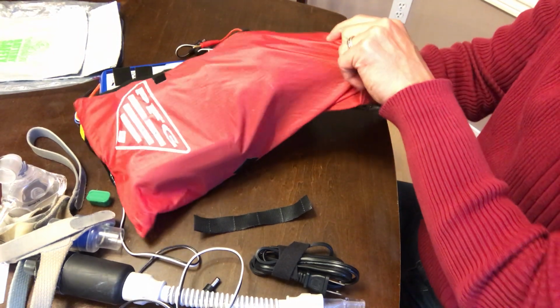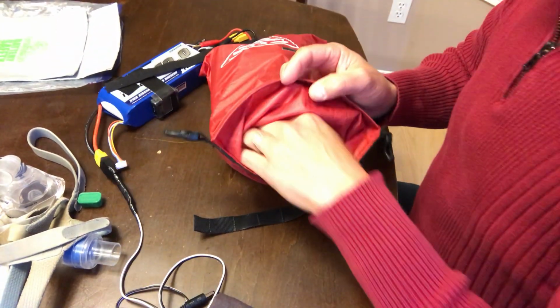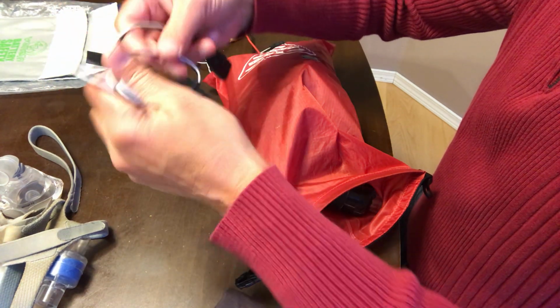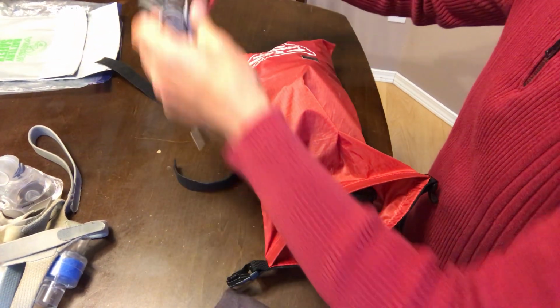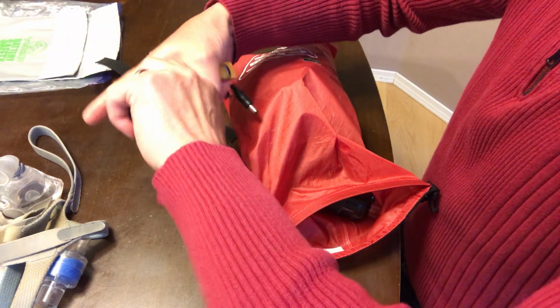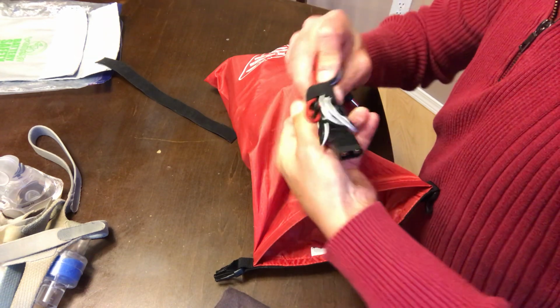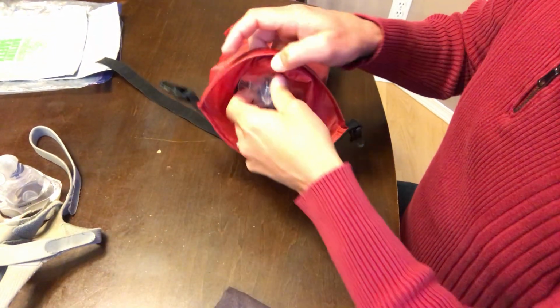And then that one would go on top of the hose. And then this one, I would put the small end in first. It would go there. And then I would just take this and fold it sideways. Put your cables in there. And then for your wires, you take these wires and fold them up. And then these ones, because you need all of these. And then this one as well. All of them bundle up nice and tight here. And those wires go on top. And your device here, all this stuff could just stuff right in the end.